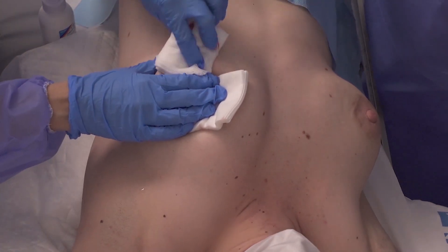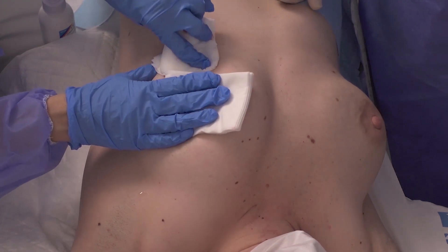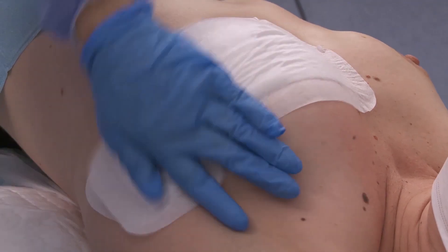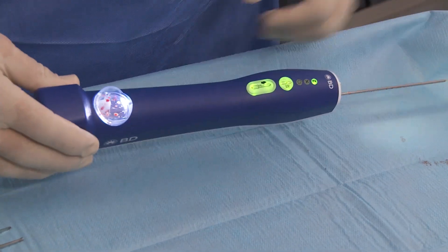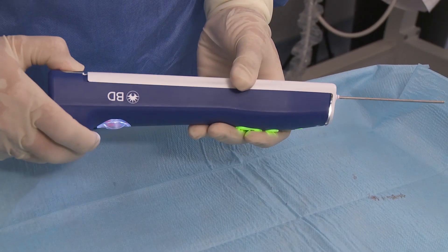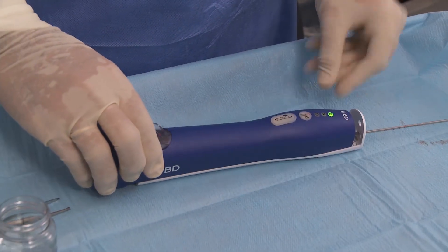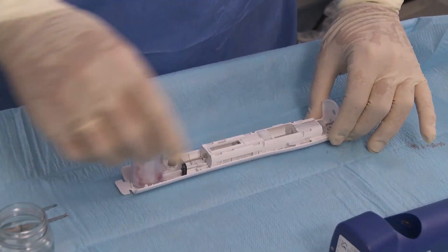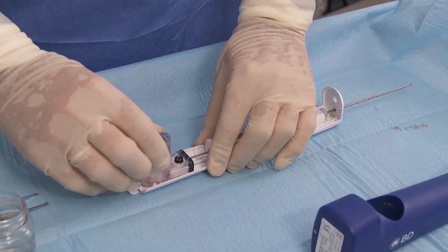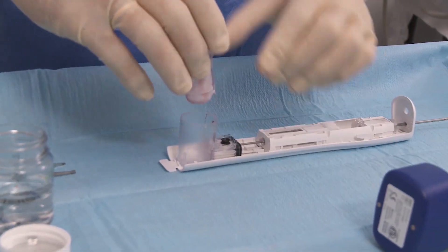Proceed with patient care: manual compression, drainage, and tight bandage. Turn the sample container anti-clockwise to remove it from the driver.